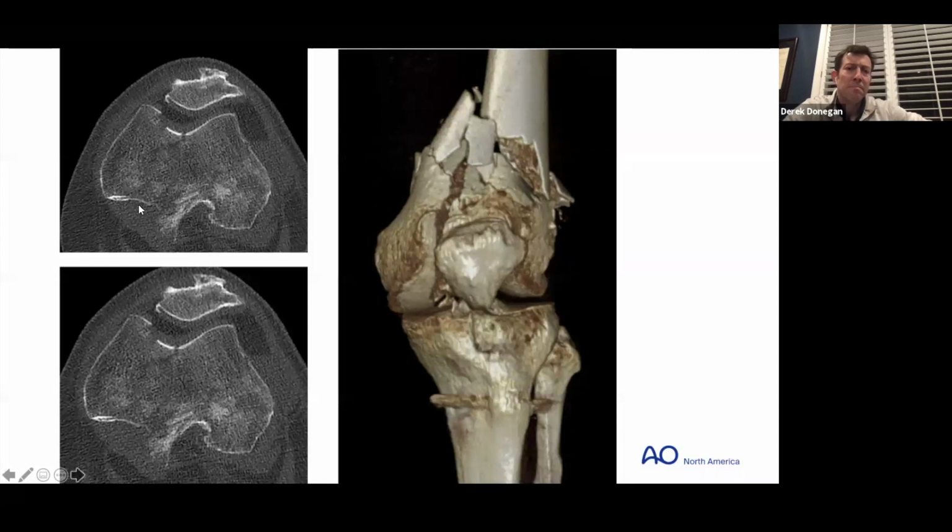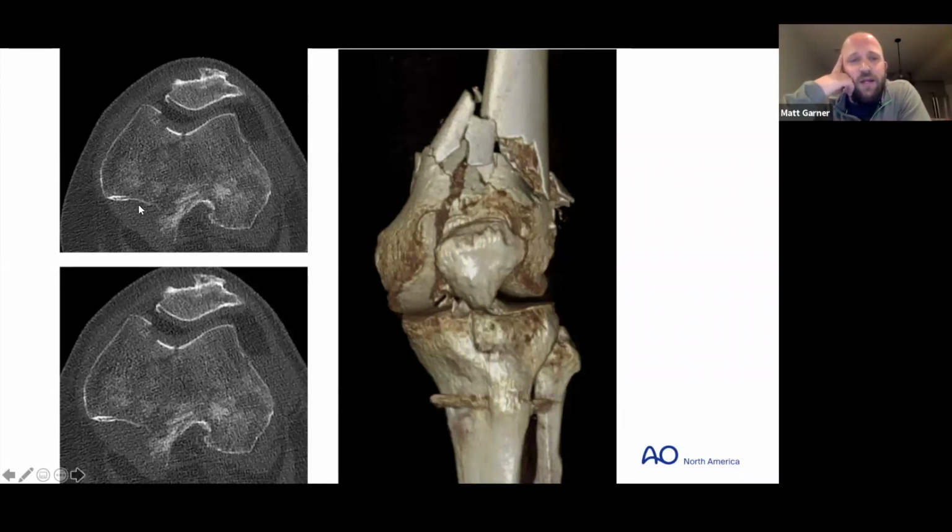Yeah. So initially I'm thinking, you need to get an anatomic reduction. There's some articular injury to this that looks fairly straightforward. A little bit of a trochlear impaction injury, which, at that age, is plus minus how much you have to really consider it. But I'm going to want to see the joint for the procedure. So the first thing I'm thinking is OR setup. I tend to do all my femurs on an OSI flat top because it's just easier for me. I'm comfortable with the setup. I'm sure the two of you do a very similar setup.